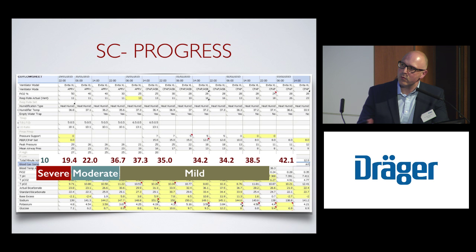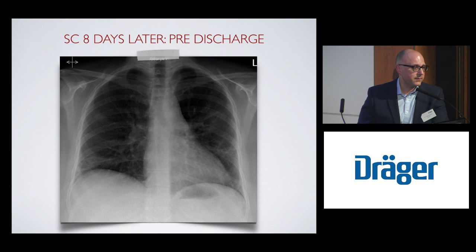And this is 8 days later. Obviously, she had a disease very responsive to treatment. She's done very well. But that's the concept of clearing edema and recruitment over time. So that lady was clearly recruited in the referring hospital, but obviously she needed that amount of time and that amount of pressure to fully recruit the airways.